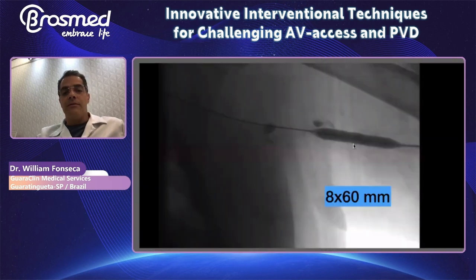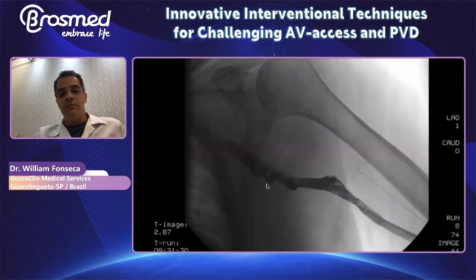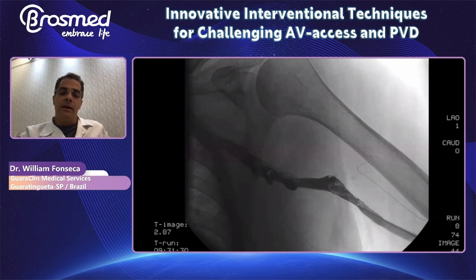You can see another case with a high stenosis with the collateral and the restriction of the flow. And after putting in the balloon, you can see a very nice result, releasing the force very softly, and showing us a nice result.